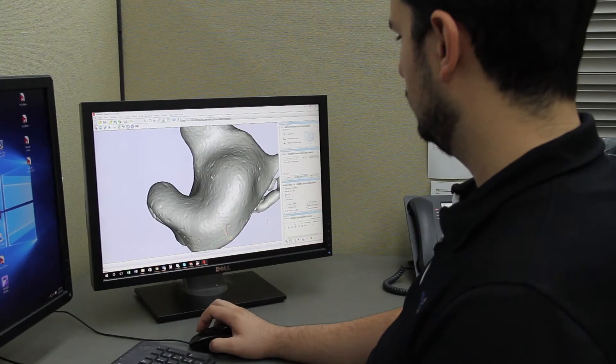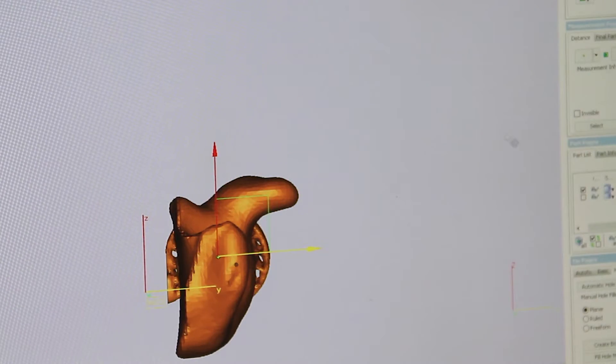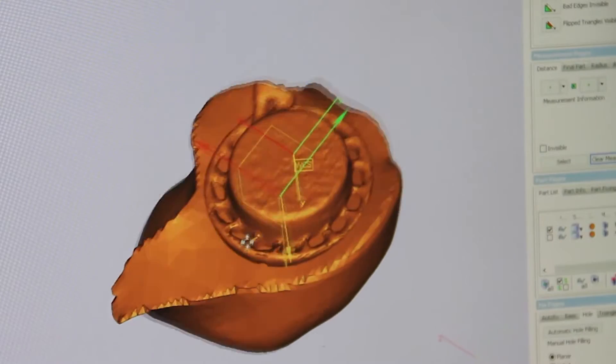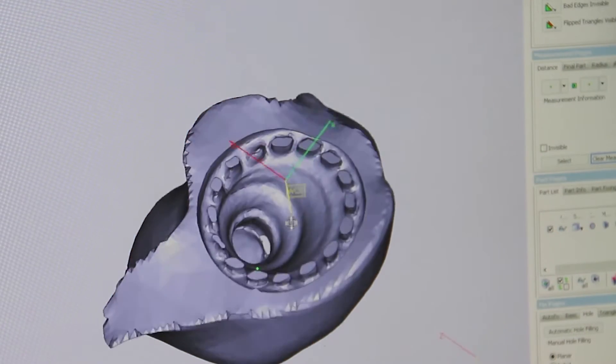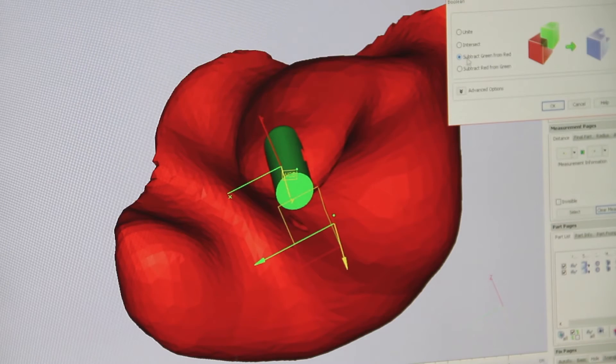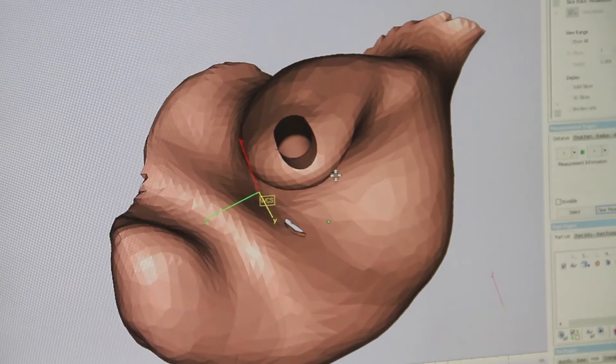We then import our shells into Magix. We can import the shell of the headphone which we have scanned along with the ear mold and position it to create a cavity to be able to snap fit them both together. Then we create a channel so that the sound can pass through.